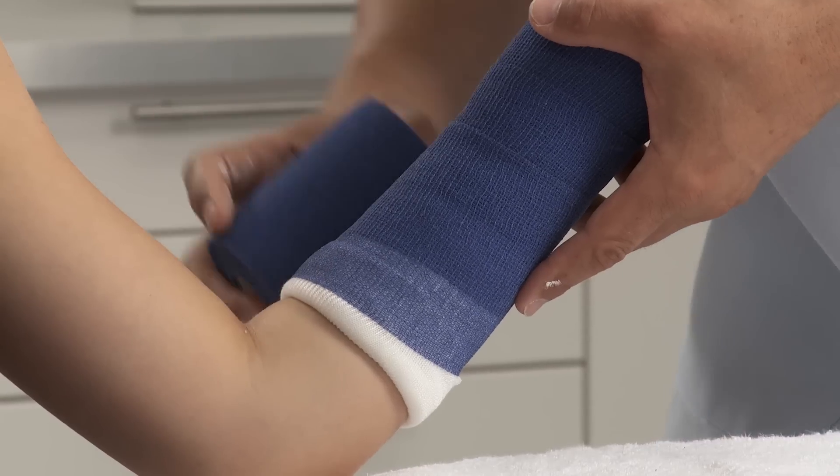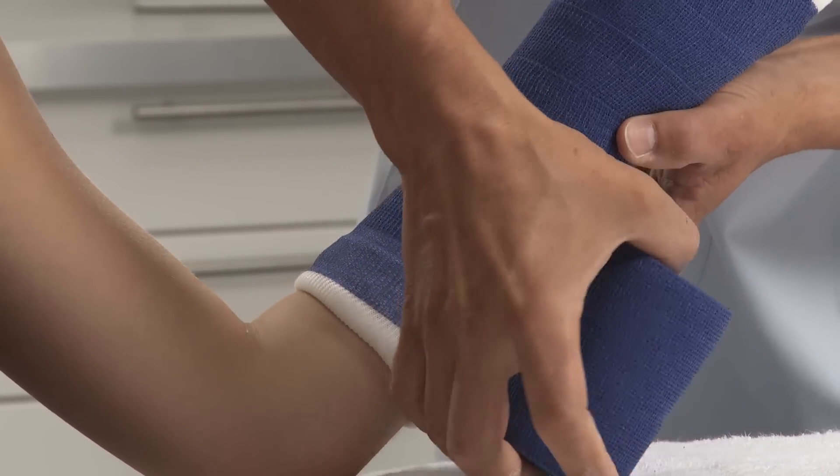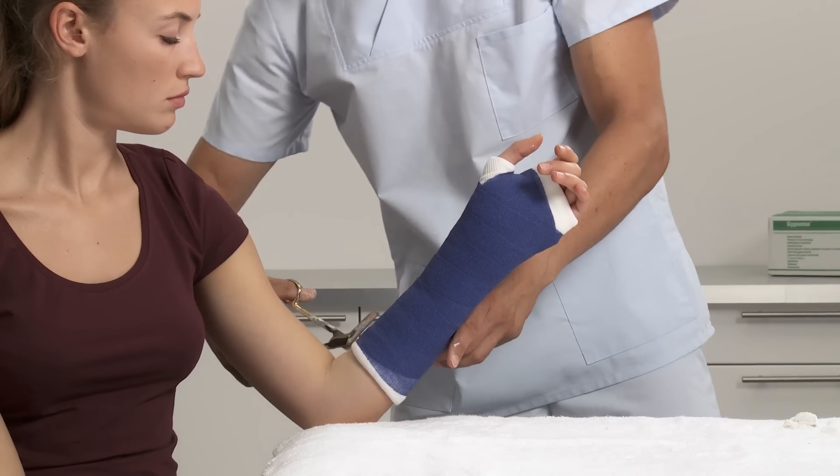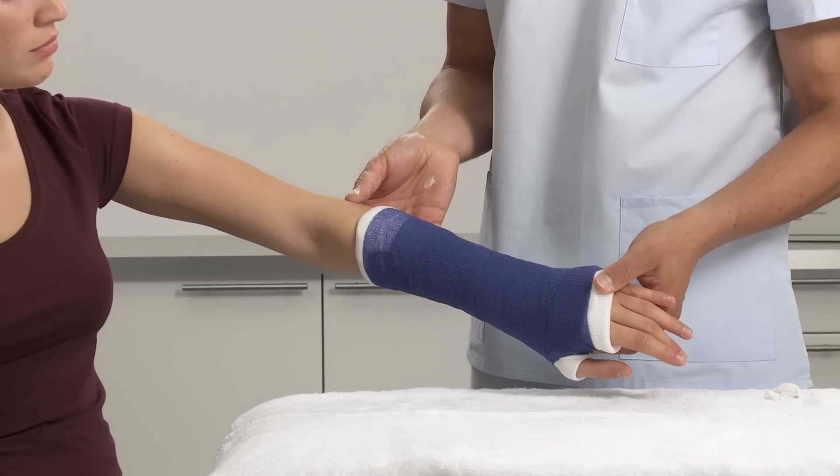Check for desired range of motion and any points that may cause irritation or pressure. After approximately 3-5 minutes, the splint is set and the patient can be released. After 24 hours, the splint is fully set.